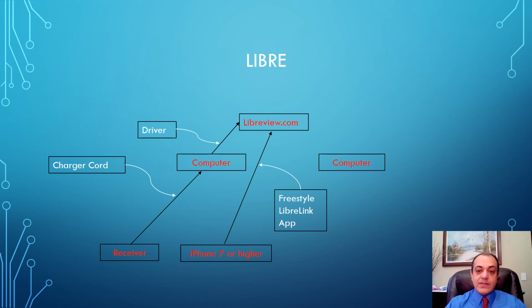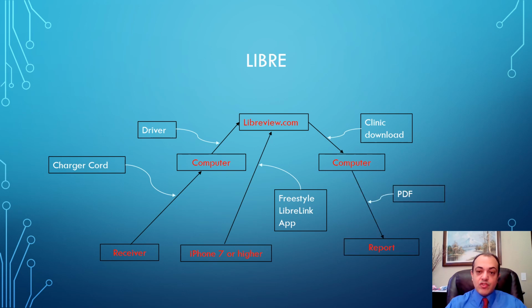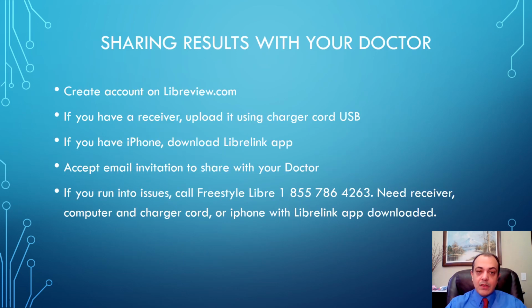In the clinic, once the results are uploaded and you have the patient in your roster of patients, you can download the results to your computer and generate a report.